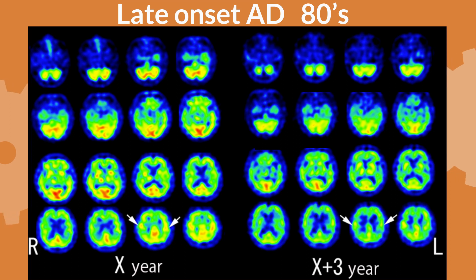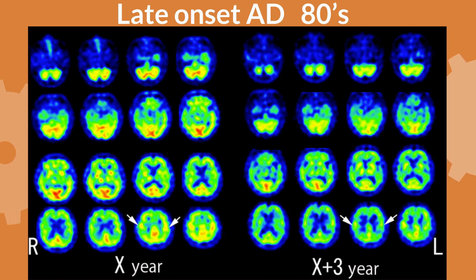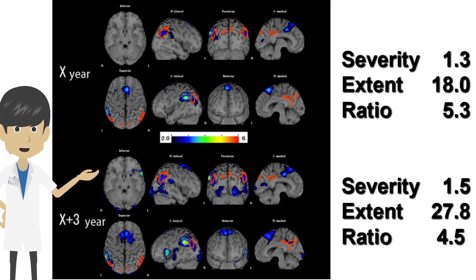In a longitudinal SPECT case of Alzheimer's disease in a patient in his 80s, at year X there is mild hypoperfusion in the left parietal cortex. Three years later, the hypoperfusion has progressed but is less pronounced than in early-onset cases; arrows indicate that perfusion in the bilateral pericentral sulcus cortex is preserved. In EZI, there is a right-dominant decrease in the bilateral parietal cortex at year X, with severity 1.3, extent 18.0%, and ratio 5.3 — above threshold but lower than early-onset Alzheimer's disease. Three years later, progressive decrease in the bilateral temporoparietal and frontal cortex was seen; severity and extent were mildly increased but ratio decreased.